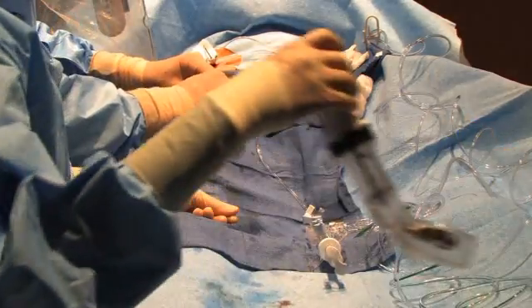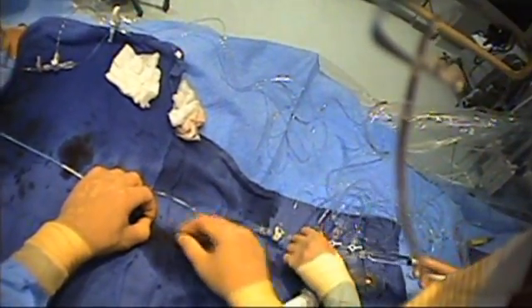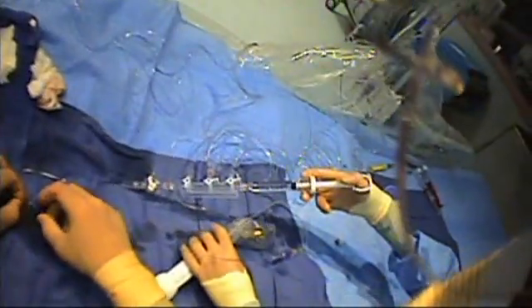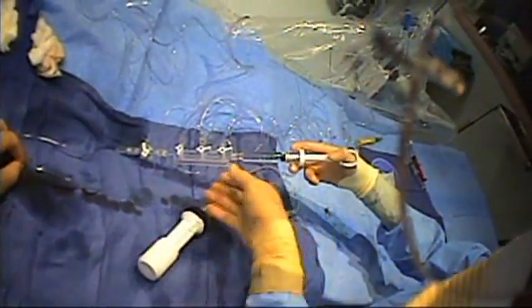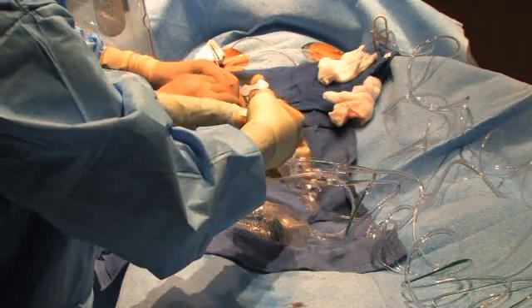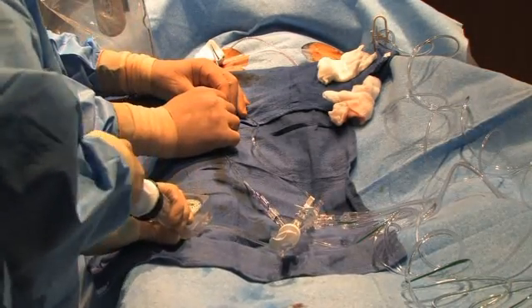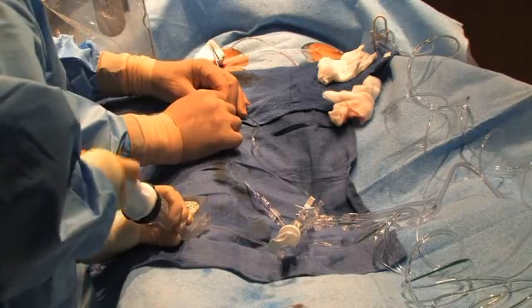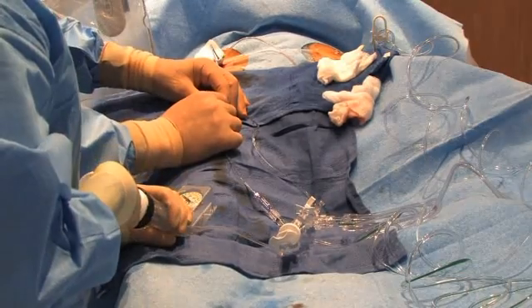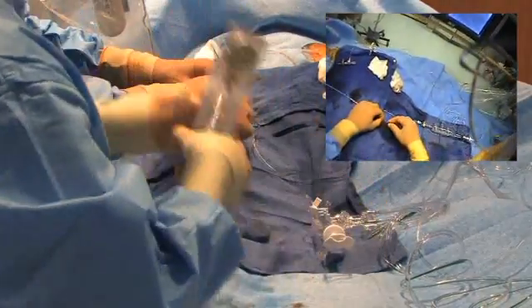Angela is holding the wire as I place this catheter into the body. At the end of this catheter is a balloon that is deflated at the current time. The other end is attached to an inflator which can inflate the balloon with contrast. Go ahead and inflate to eight atmospheres — and down. Coming out with the balloon.